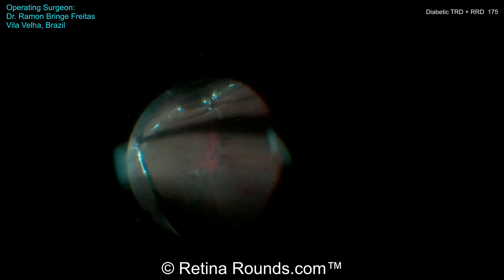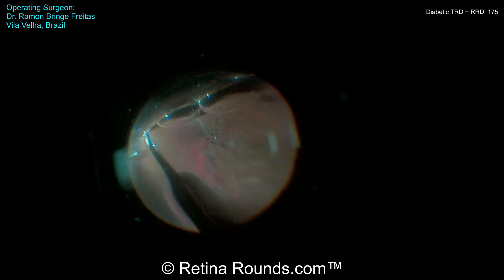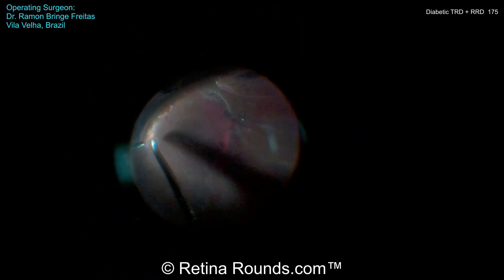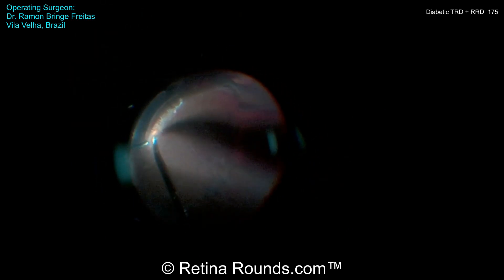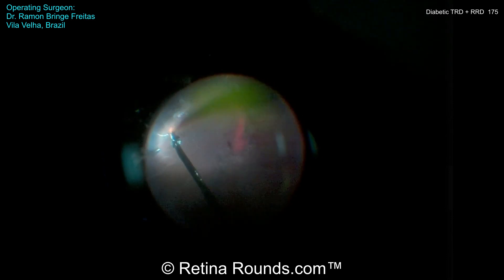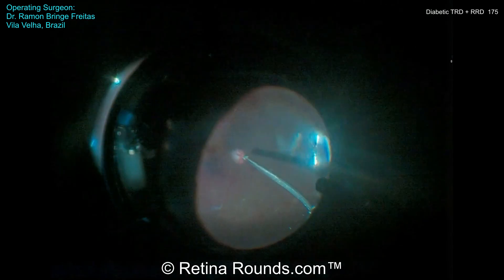He's gone to an air-fluid exchange and is draining through the peripheral retinal breaks, tilting the eye to bring any fluid into the dependent position at those peripheral breaks. An option here would be to drain through the more posterior retinal breaks to get a more complete flattening of the retina, which can help to get more complete laser takes — which he's now applying. You can see the laser retinopexy being applied around the retinal breaks. We're getting some inconsistent takes on the posterior side of those retinal breaks because there is some residual subretinal fluid present. Draining through the posterior breaks, rather than the peripheral breaks, can help to better flatten the retina.